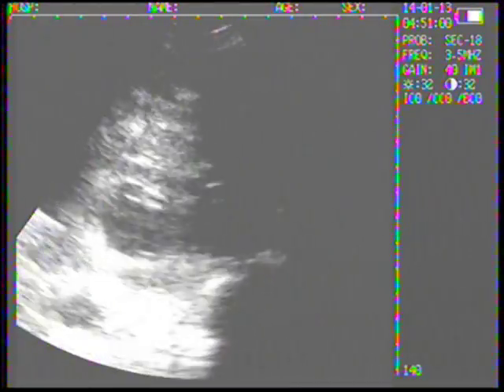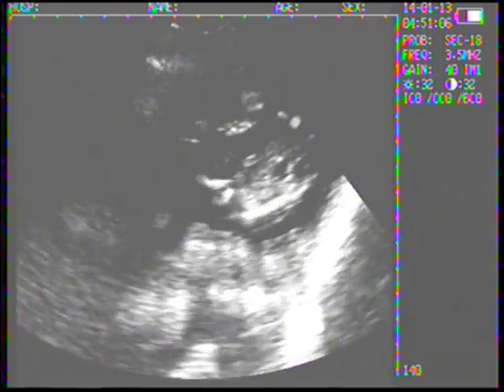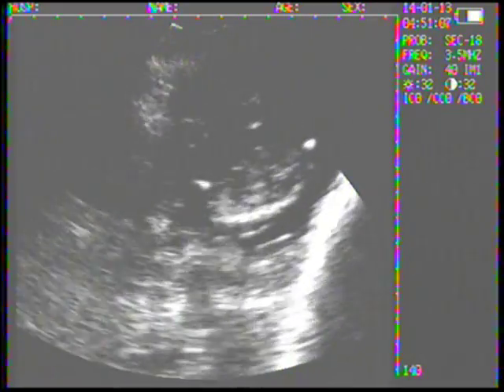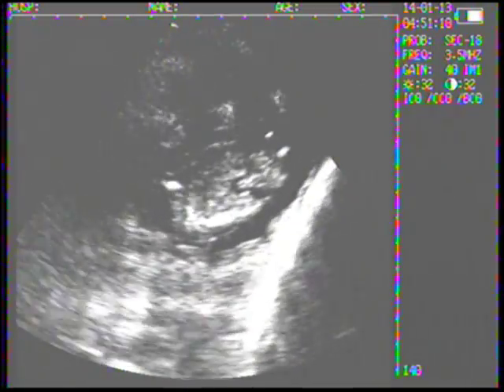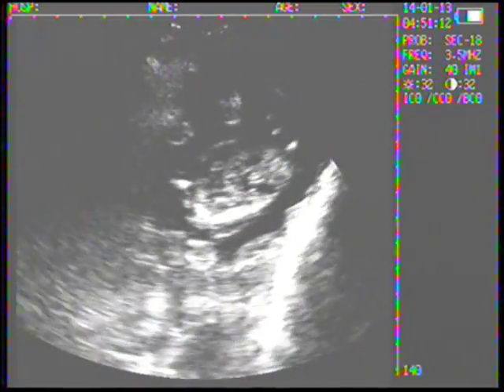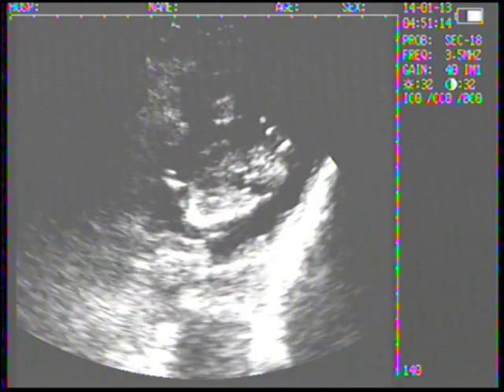In this clip you will see video captured from the ultrasound itself, so you can see how the image appears on the screen. When scanning, what you will be looking for is a good sized area of black, which is the amniotic fluid surrounding what will look like — what some people have described as — a donut in the early stages of pregnancy.